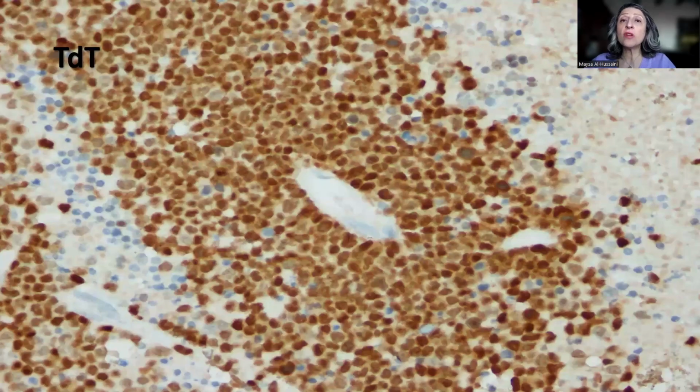and this was confirmed further by immunostains, where we have the nuclear positive staining with TdT, confirming that this is an acute leukemia. Please note here the concentration of the leukemic infiltrate around the vessels. So this is an angiocentric pattern of proliferation, and away from the vessels, the tumor shows necrosis, typical of high-grade tumors or embryonal tumors.